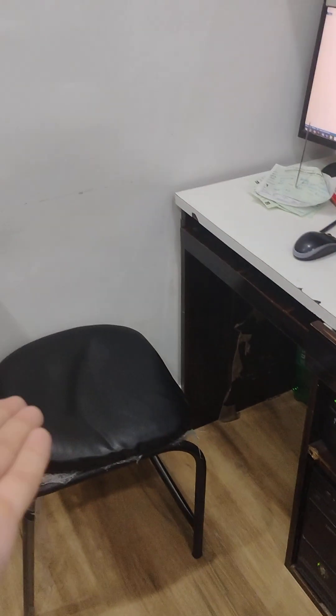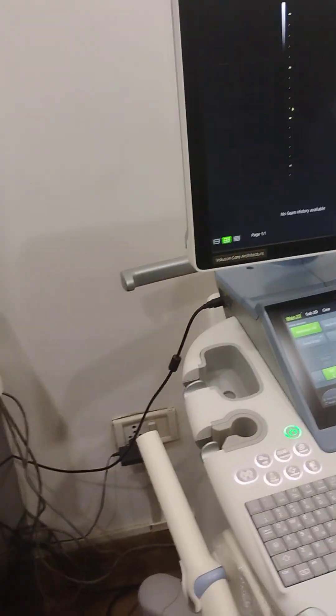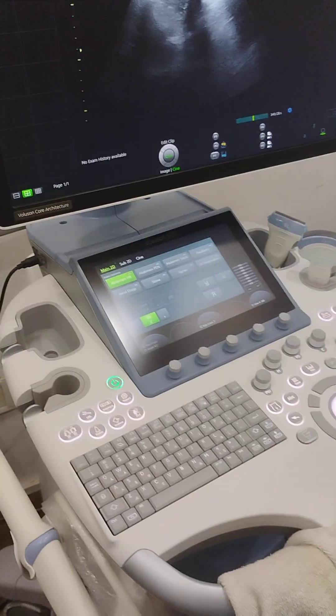You have the whole setup here — a printer, a computer, and the typist sits here. The doctor basically sits here and utters all the findings; the typist just notes them down and then makes a report.